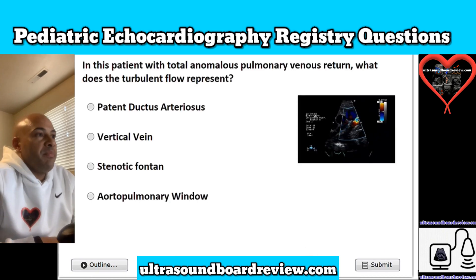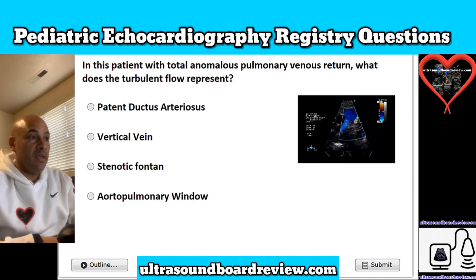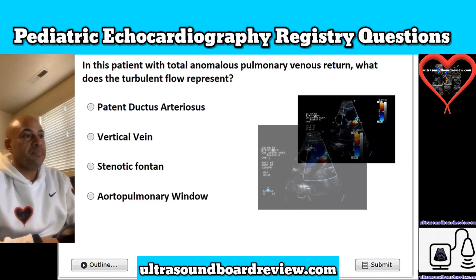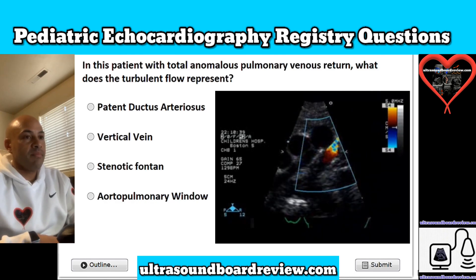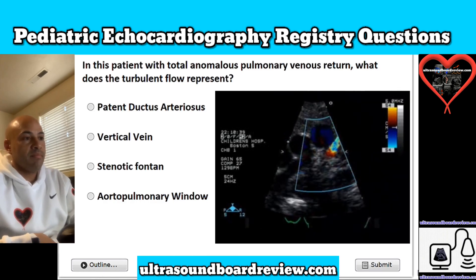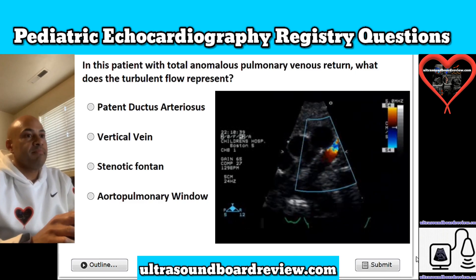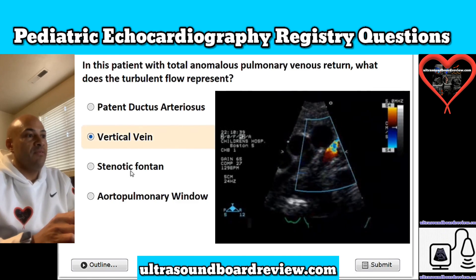Question 21. In this patient with total anomalous pulmonary venous return, what does the turbulent flow represent? Is it A, a patent ductus arteriosus; B, vertical vein; C, stenotic Fontan; or D, aortopulmonary window? The answer is B, vertical vein.